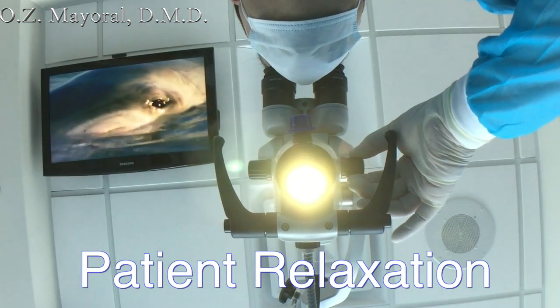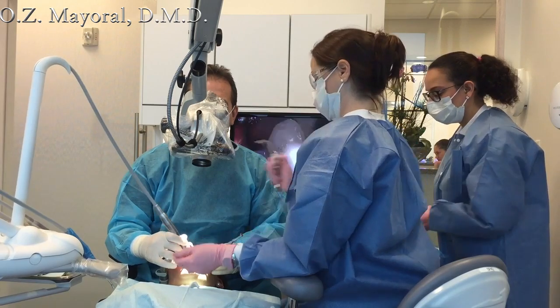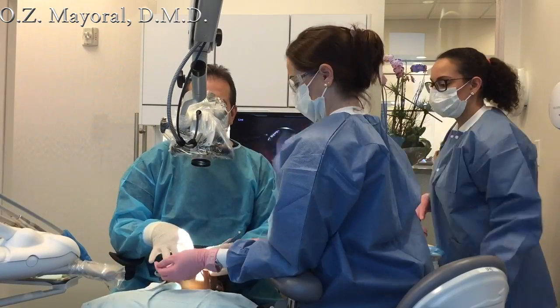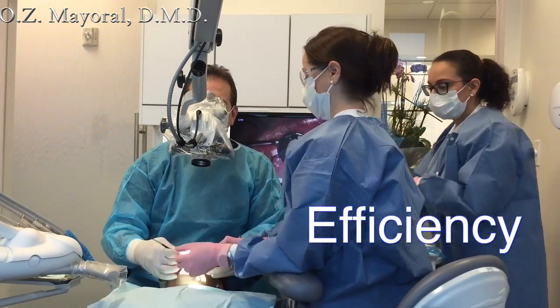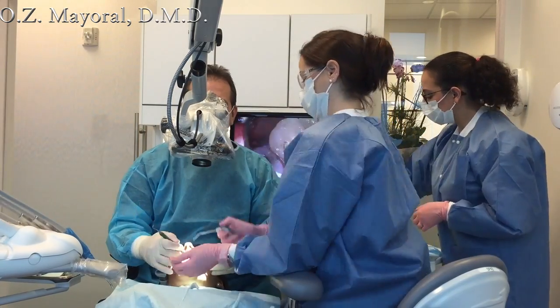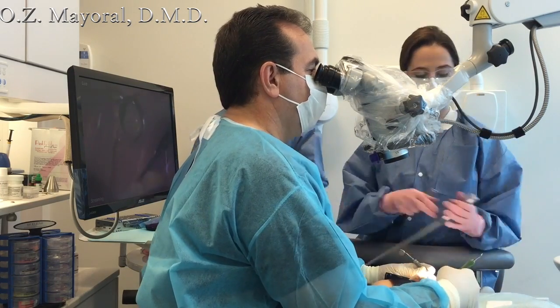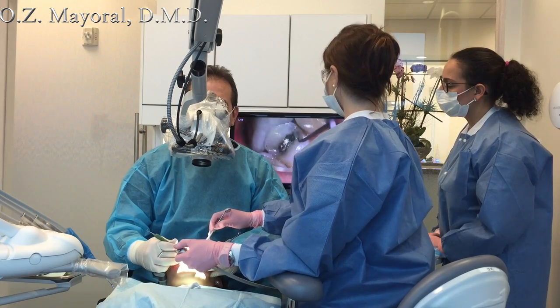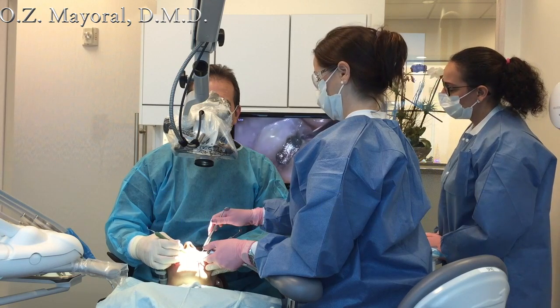Okay, Sally, can you see the monitor that's right up above my head here? All right, let's do it. We've changed the input on the TV up there, and we've actually got you where you can see what I'm looking at through the microscope. Can you see your teeth up there?